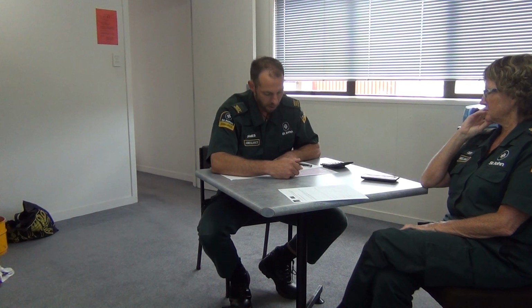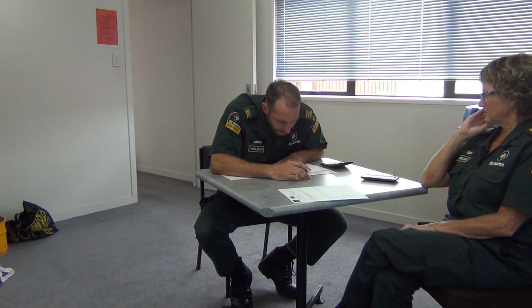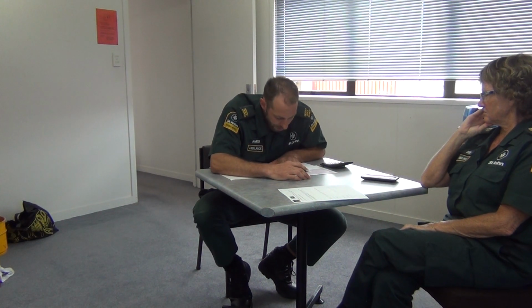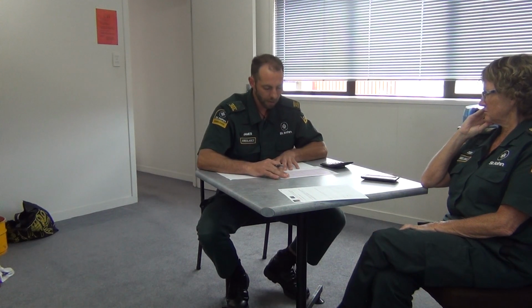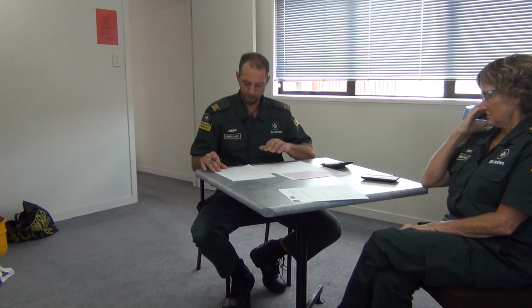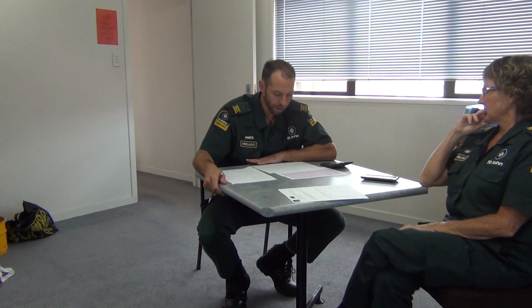In the lateral leads we've got elevation of 2 mil in V5 and 2.5 mils in V6. So that's quite a concern, this sort of widespread ischemia.